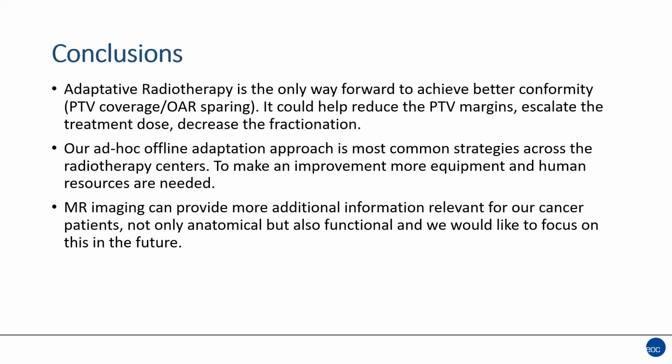Our ad hoc offline adaptation approach is still the most common strategy across radiotherapy centers. And of course, we can make improvements. Improvements could always be done, so we are looking forward to doing that.